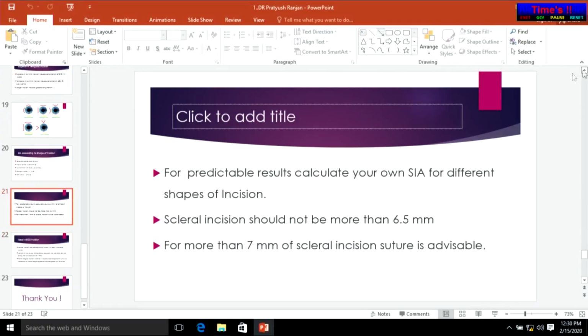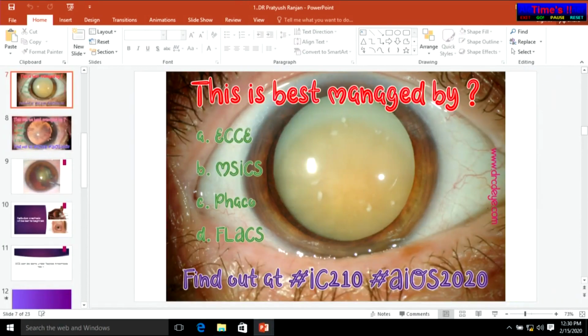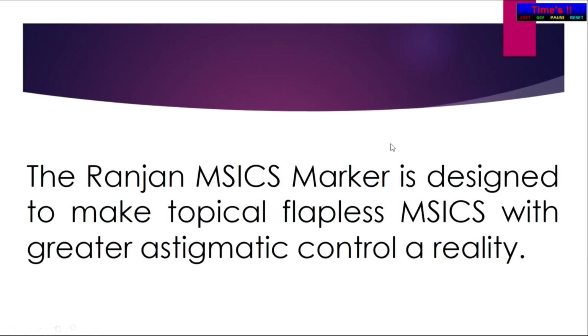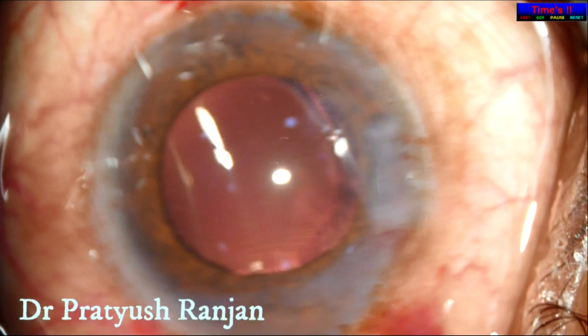So you just notice continuously there was fluid being poured onto it, so that you have a very clear view of where his plane is. That is one thing which is difficult if you have a conjunctival flap covering your sclera. Why is there a need for transconjunctival? Why shouldn't we? It's just to make your surgery faster. Just a different technique. Again, I'm telling you, all techniques should not be applied blindly to everyone.